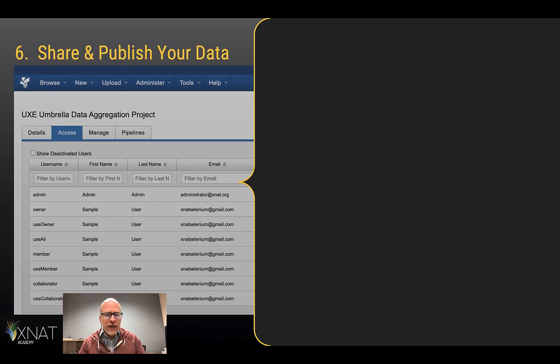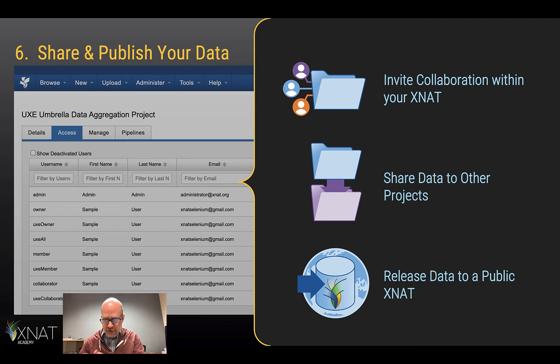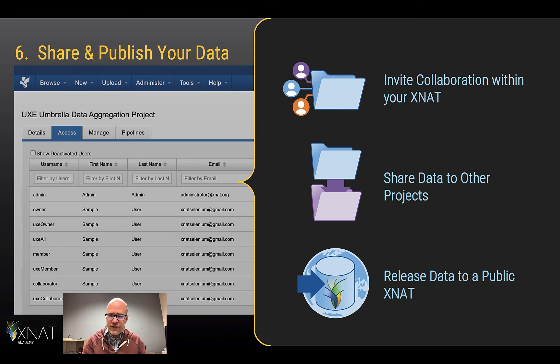And then when you've got your data ready to share, you can invite collaboration within your XNAT. You could share the data to other projects, or you could even push the data out as a public release to a public XNAT.